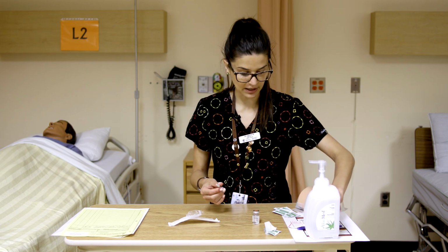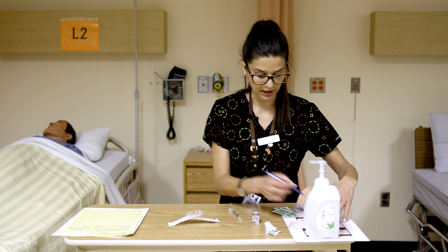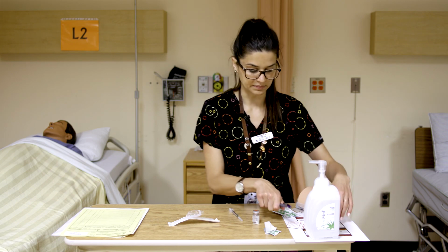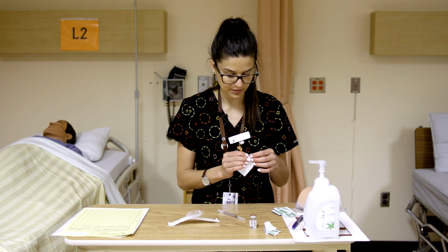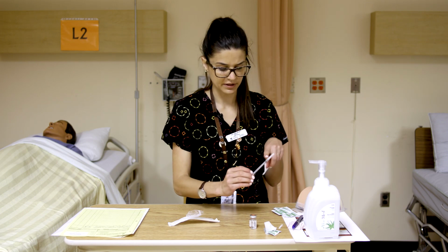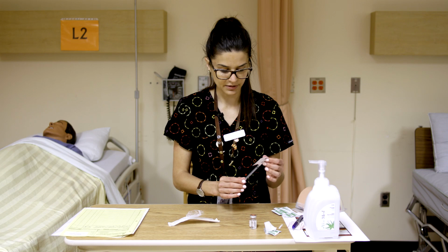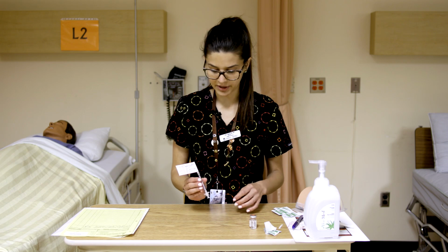So just like in lab, as we expect with any med admin, once you've prepared your medication, you're going to want to make a medication label before you move on to either the next medication or really anything else, because now we need to always know what's in this syringe. So we've made a label. We're going to attach this to our syringe, and just like with the oral syringe, you want to put it somewhere where it's not going to affect your view of the markings. I tend to like to put it right on the cap, especially for you guys because you are reusing your syringes. It's a good way to preserve them too. So this is more or less ready to go now.